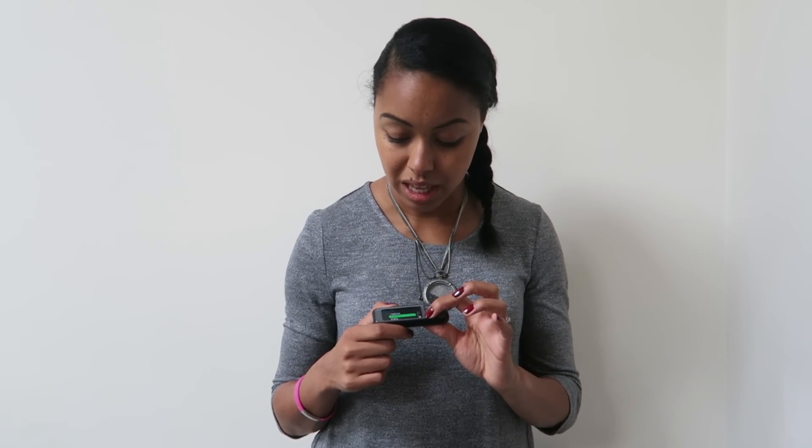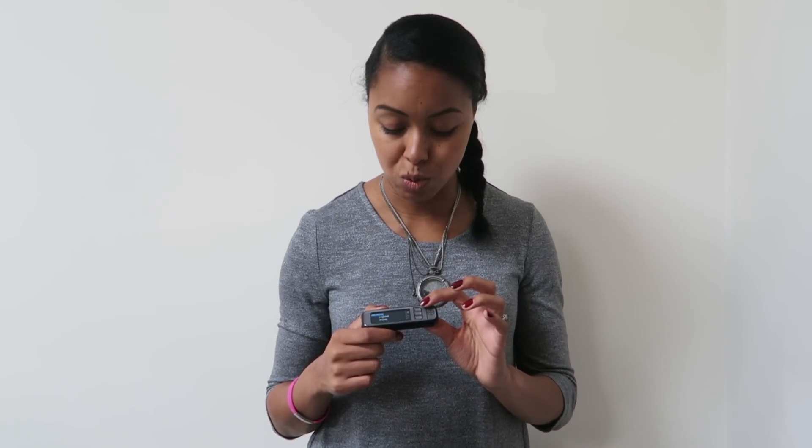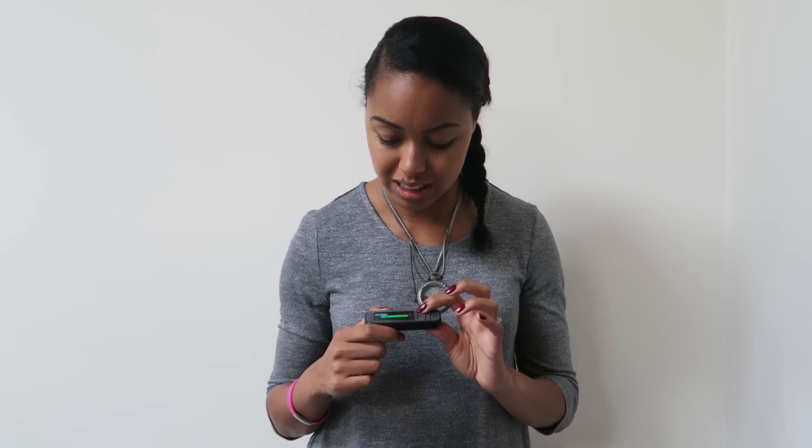It comes up straight away on the menu — you've got the bolus option at the top, you've also got the logbook, trends, and setup as well. So there are lots of options there.